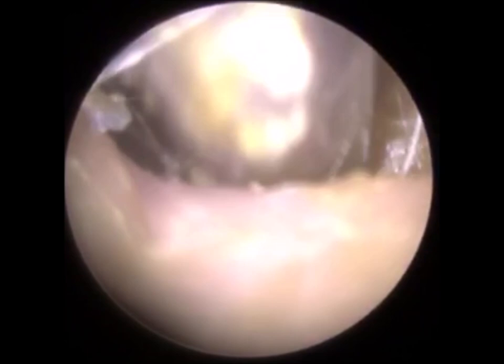Few cilia, a few hairs at the entrance. People often say, why don't you cut them? Why don't you trim them? Well, I don't really need to. It's not affecting me. With any procedure, you only do a procedure if it provides clinical benefit. And it may not make for the best viewing, but I'm not making these videos for the sole pleasure of people watching it. I'm doing it to help a patient, and it's a clinical procedure. So there's absolutely no need, in this case anyway, to remove those hairs.